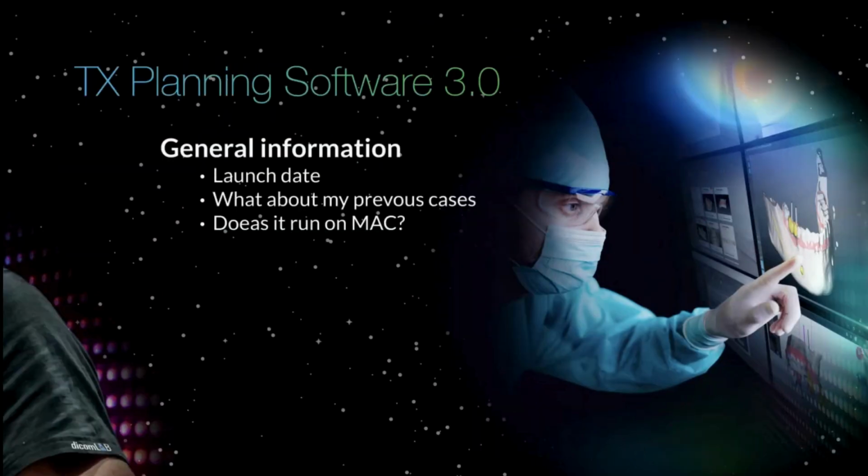So some general information at the beginning. The launch date of the new version of the software was this Monday, so 2 days ago, in Western Europe. We have been beta testing for over 1 year, with superb success. So basically, it's safe to say that it works very well, and you are not the first ones who will try it out. And we are very proud to announce that we received the MDR certification over a year ago, and we are also seeking FDA approval for the US market.